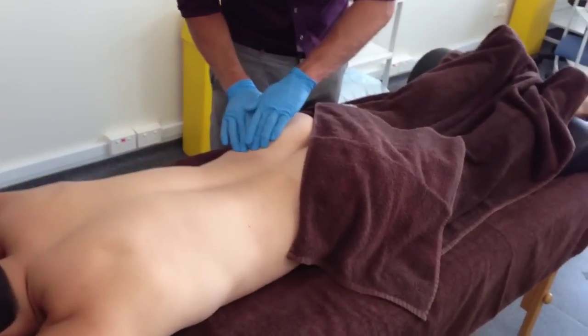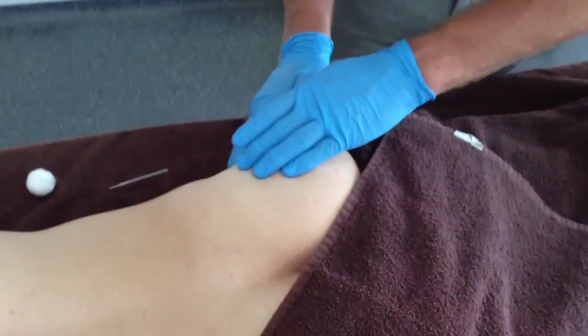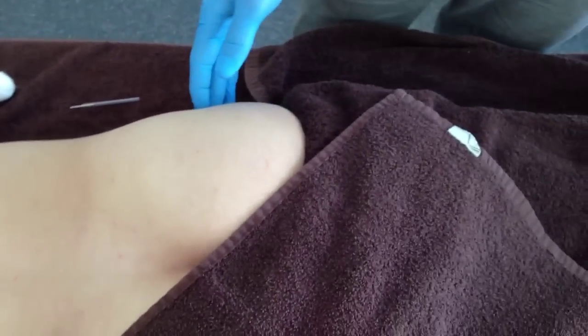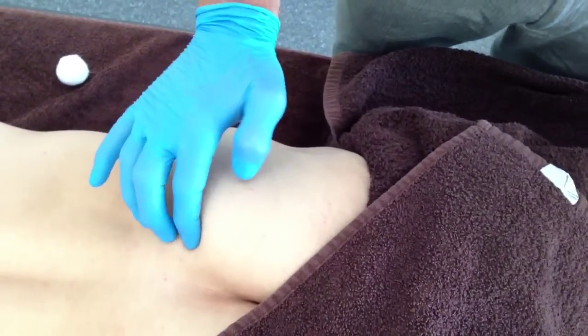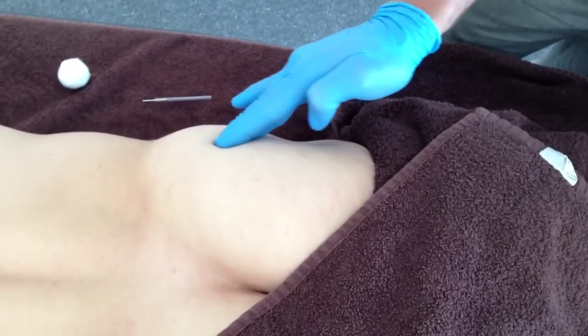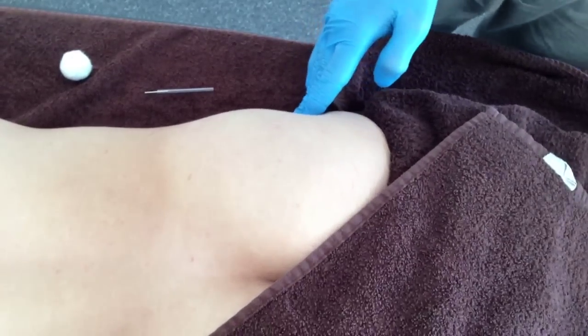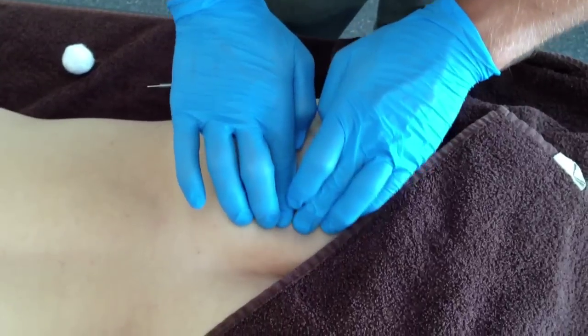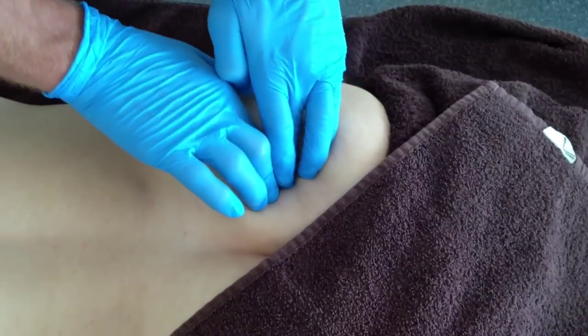This video shows the correct draping and dry needling techniques for the most superior of the three glute max trigger points. The borders of glute max can be differentiated using palpation during active bent knee hip extension. Specific palpation can then be used to isolate the trigger point prior to needle insertion.